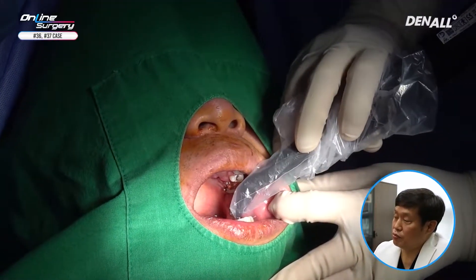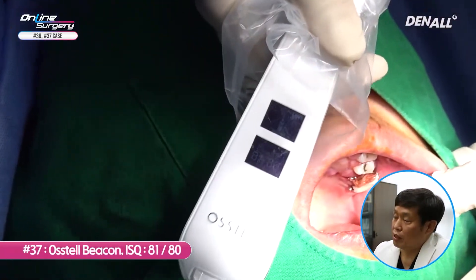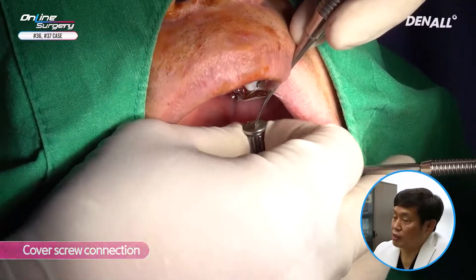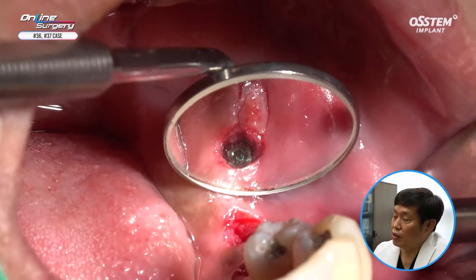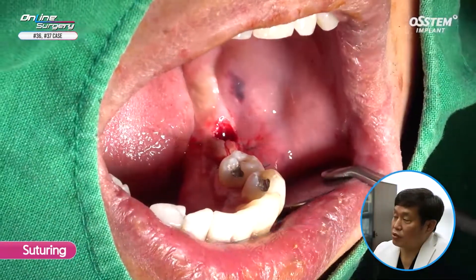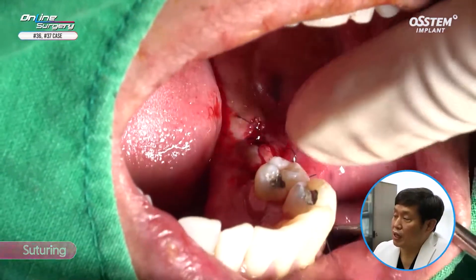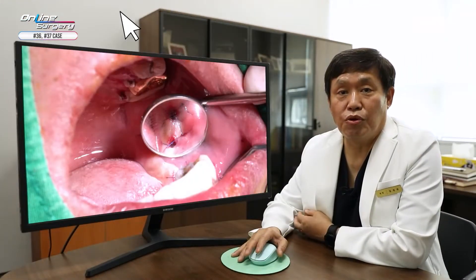In number 36, primary stability is slightly lacking. For number 37, SmartPak is used to measure the ISQ value — it's about 80–81. So number 37 is not an issue, but number 36 — I think it is better to submerge it. Therefore, I use a cover screw for both number 36 and 37. In the area where tissue punch was done, I'm just going to suture without fully closing it, and wait. About three months later, the second surgery will be done. This is how the surgery was completed.